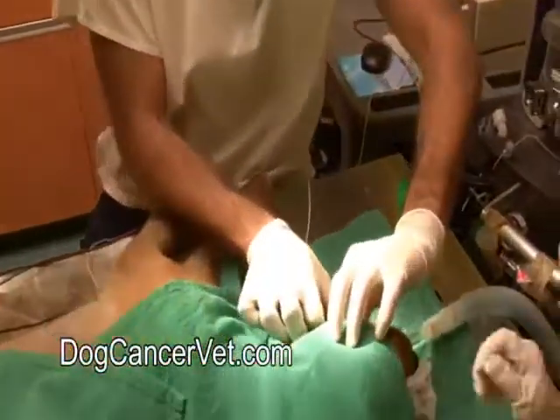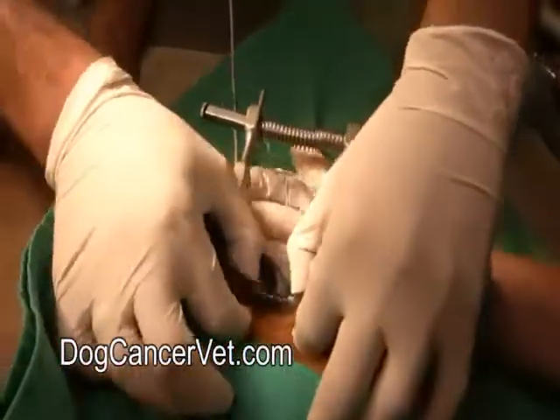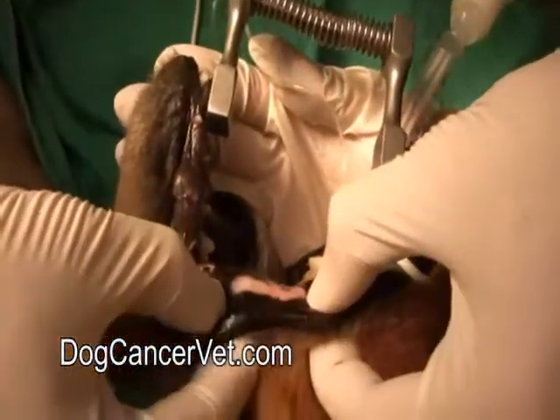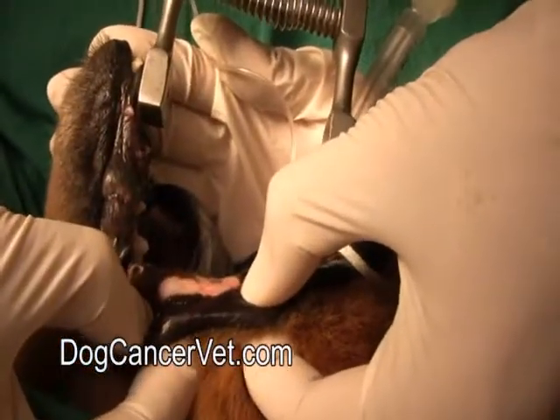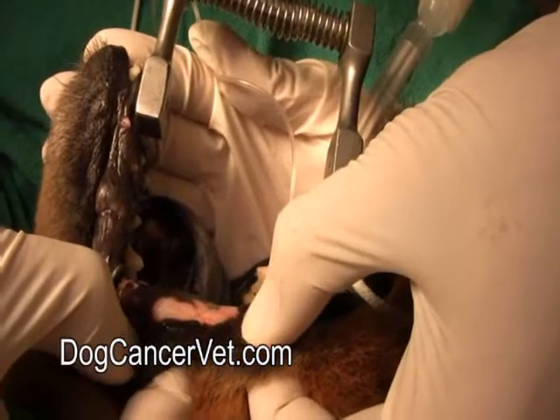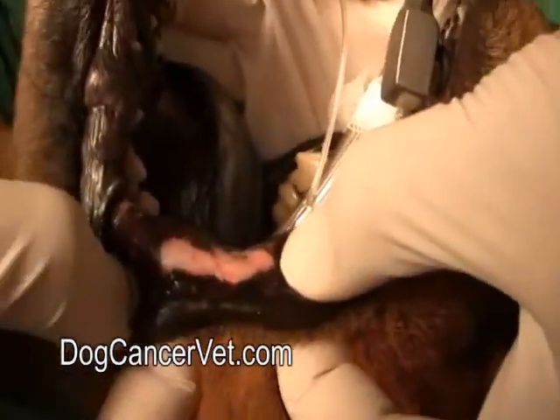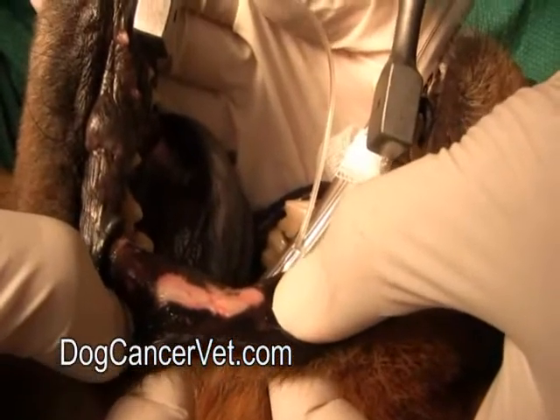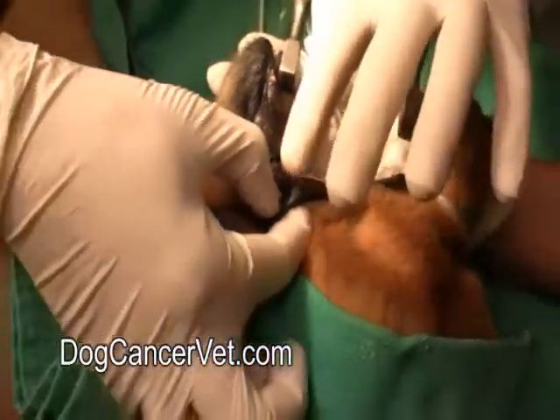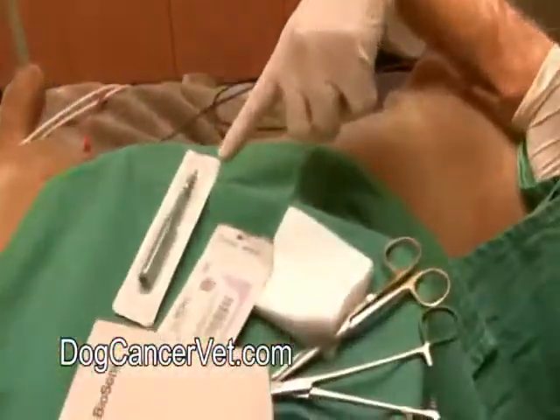What we're looking at over here is we're going to be biopsying this lesion right here, which is on the inner surface of Bjorn's left cheek. If you can take a look at it, you can see that it's ulcerated and depigmented. Ulceration just means the surface is kind of like a crater, and depigmentation means that it's a different color compared to the rest of the area around it.